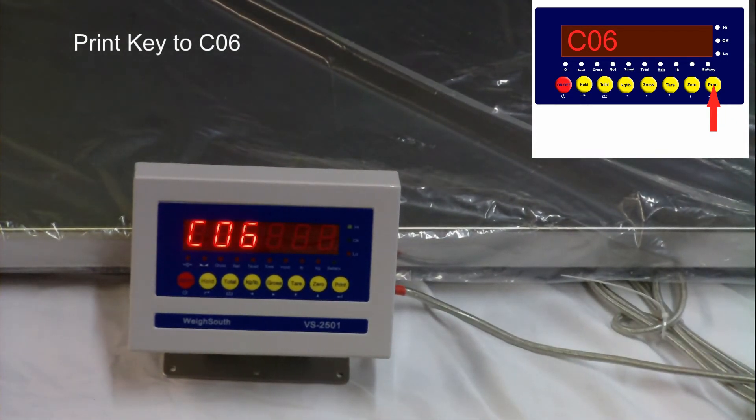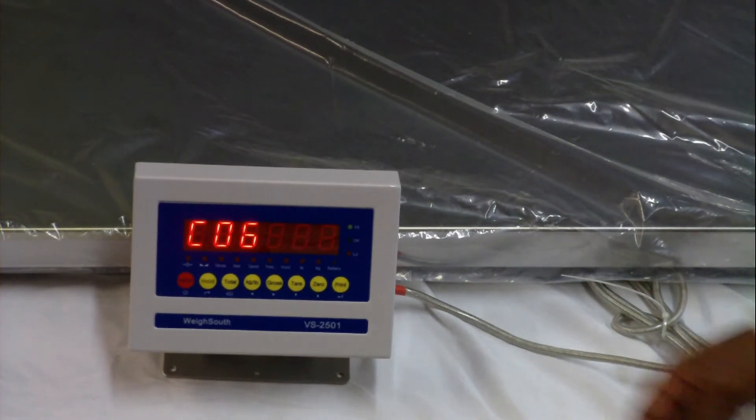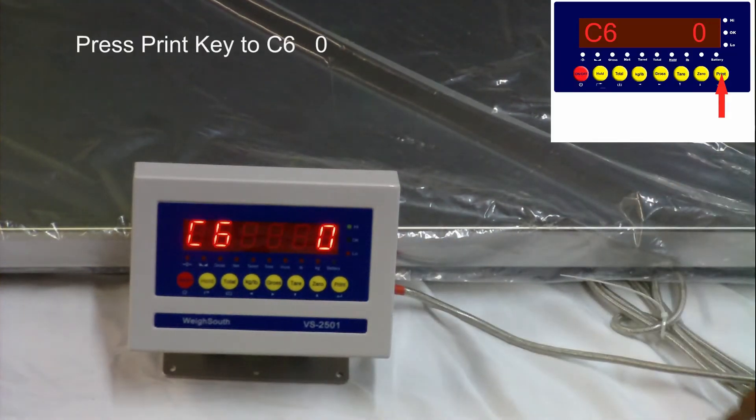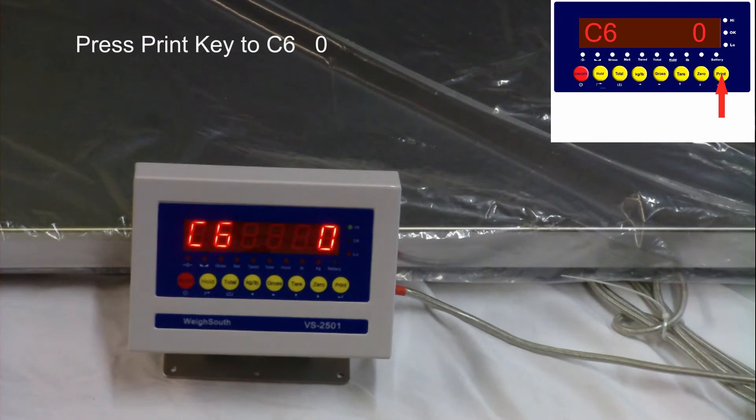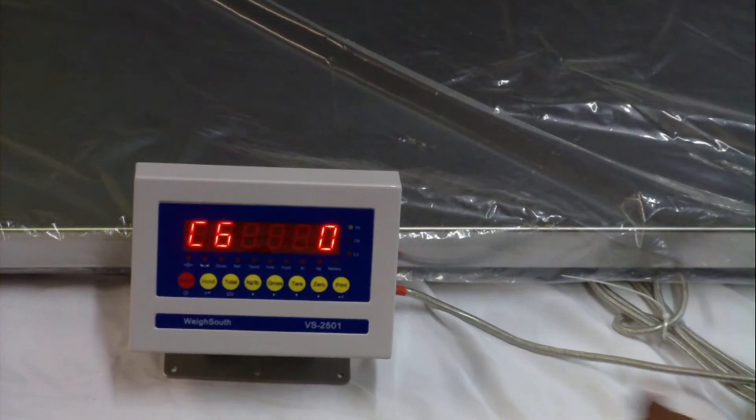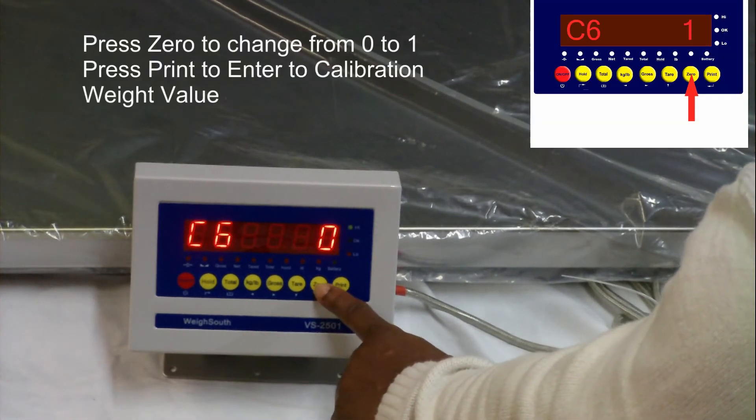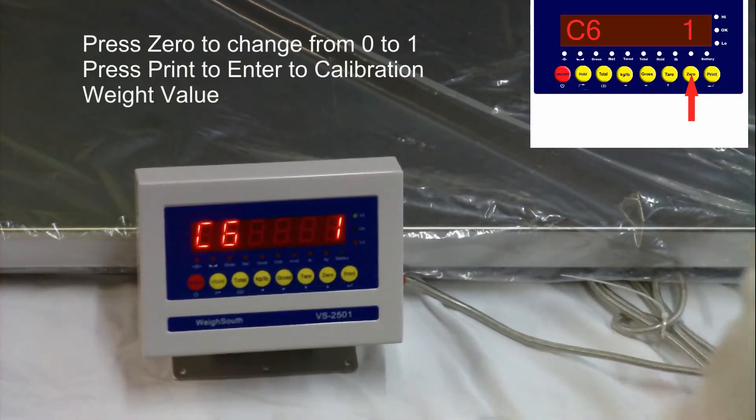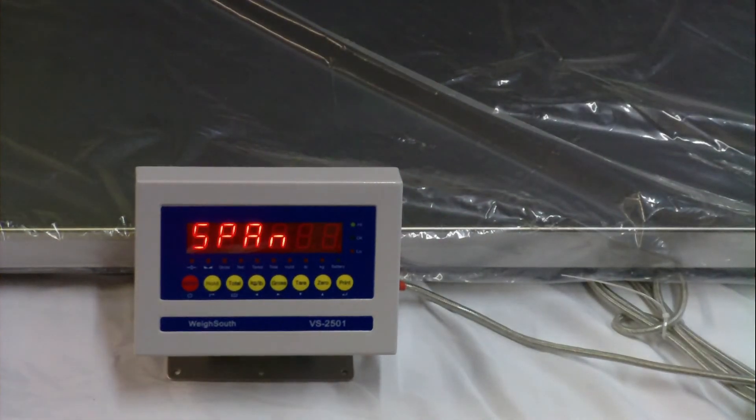Display will move and show C06. Enter the C06 submenu by pressing the print key. Your indicator will now display menu C6, submenu 0. Change the submenu from 0 to 1 by pressing the zero key and press the print key. Your indicator will flash span and then settle on a calibration weight data.